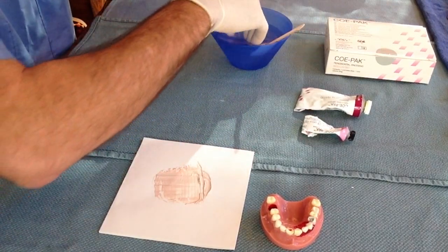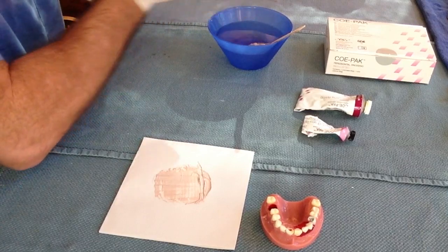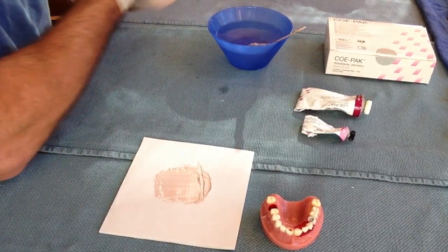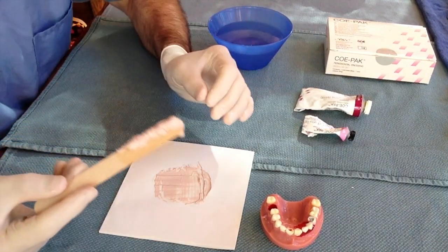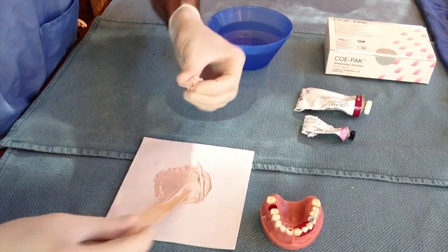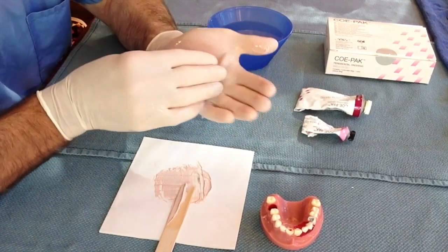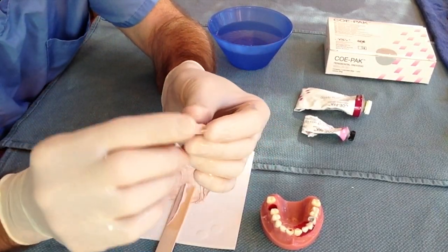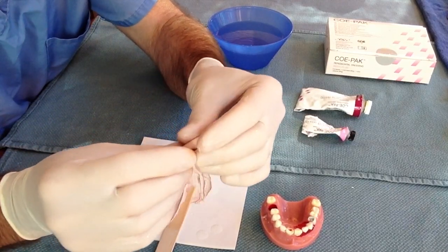When it becomes thick, scoop up the paste with the tongue blade and place the paste and the tongue blade into a basin of water. While the mixture is sitting in the water, use the water to soak your gloves. The Copac will stick to anything that is dry, so your gloves must be completely wet. Now with wet hands, pull the Copac off of the tongue blade and roll the paste into a cigar shape. If the Copac begins sticking to your gloves, dunk your hands back into the water and get them wet.